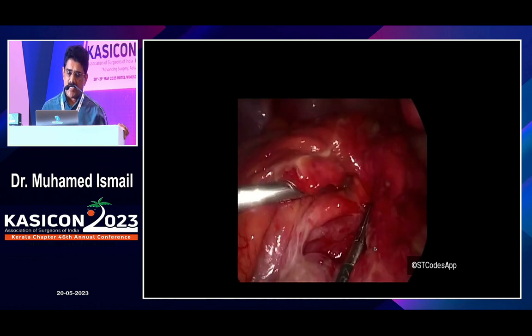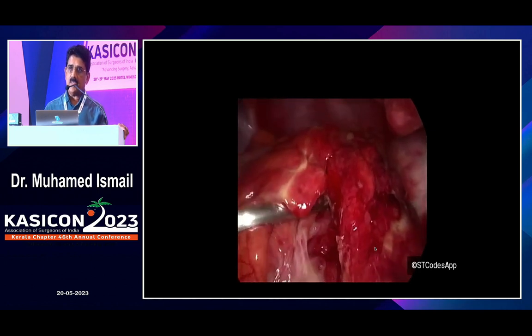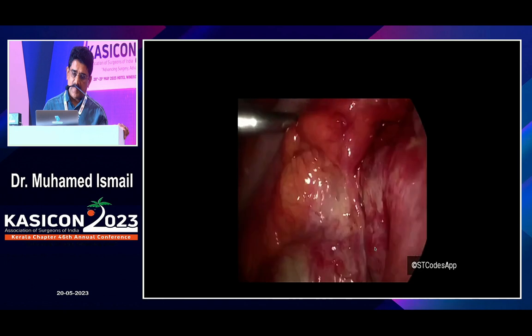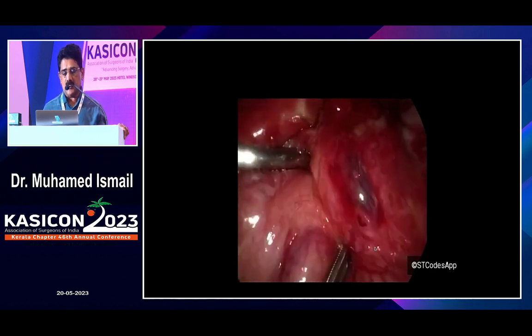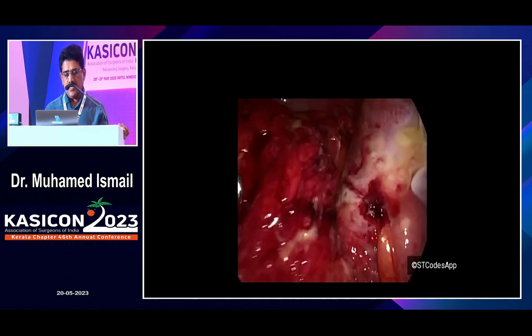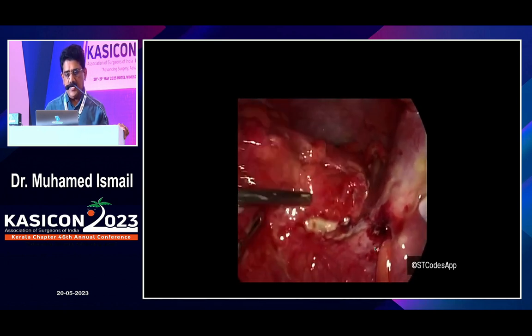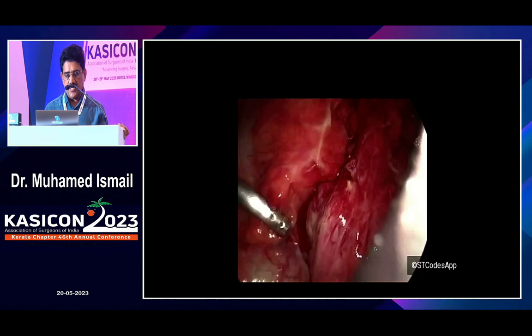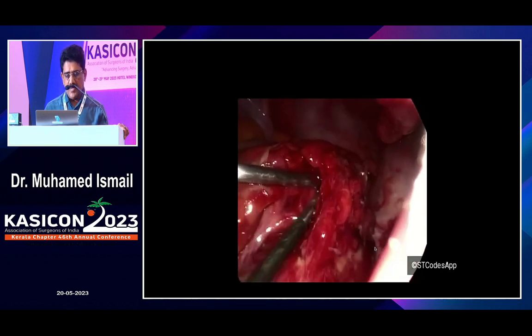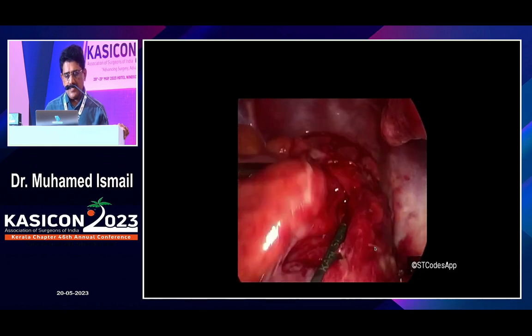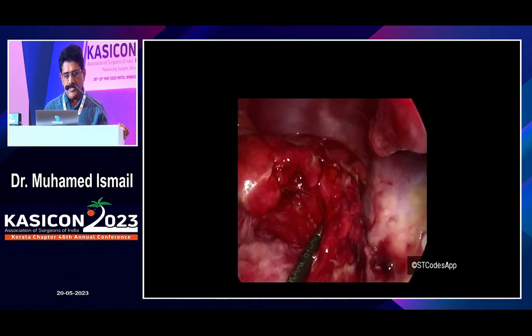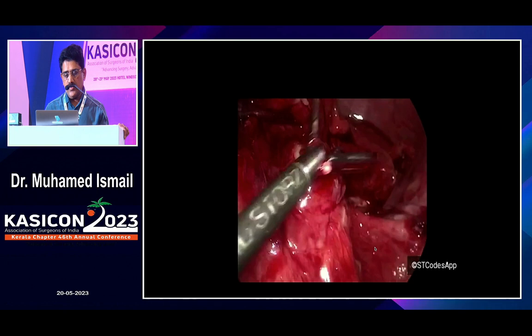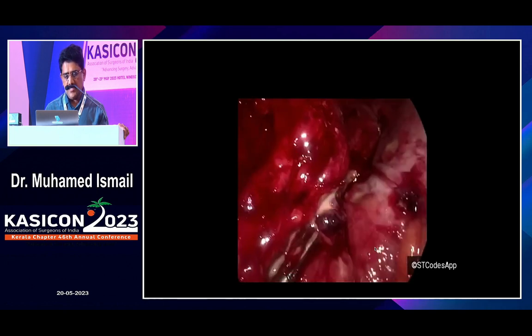As the CT clearly showed appendicular perforation, we tried to dissect the adhesions. Always look for two or three landmarks when dealing with a mass like this — identify the taenia coli and try to reach a tubular structure. Once you release the adhesions, you can look for the tip of the appendix. Here you can see the sigmoid, and there was a tubular structure with omentum. We tried to release the adhesions and the omentum. Hydrodissection is very helpful in these situations, and you can see the pus pouring out.